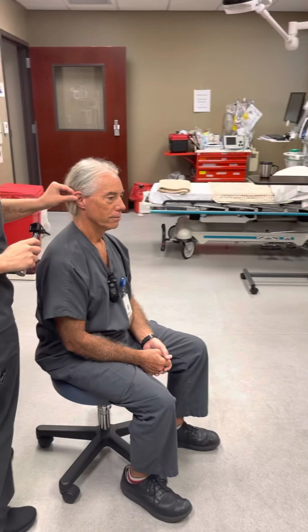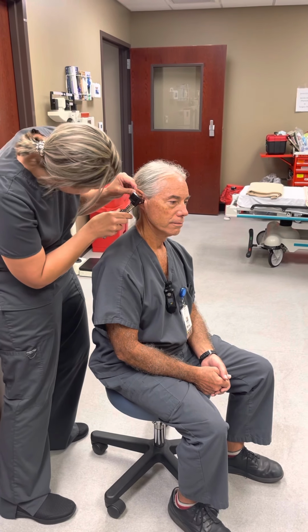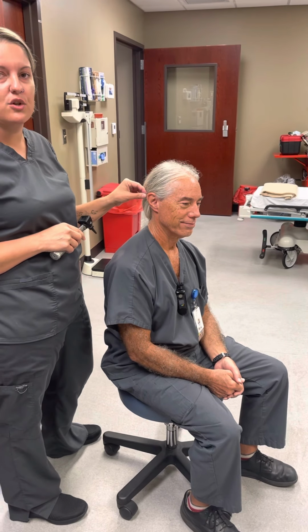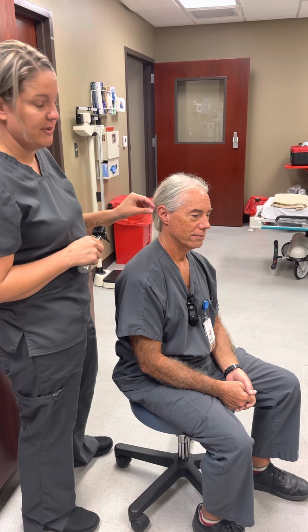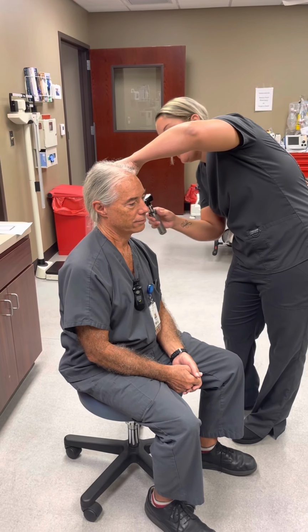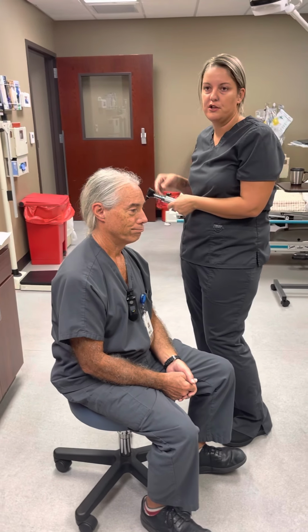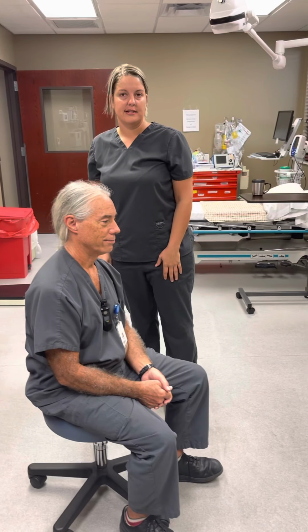Okay, and then I put the speculum on the otoscope, and then I'm gonna look inside his ear. So I'm gonna pull the ear up and back, rotate in, and look inside. The tympanic membrane should be pearly gray. It should not hurt. Any redness or bulging could be inflammation or irritation in there. It should be pearly gray, and that is. And then we'll check this side, up and back, rotate, and it's pearly gray. Okay. And their earwax is normal, but you should be able to see the membrane, and it shouldn't be red or inflamed. And that's it with our ear and eye.